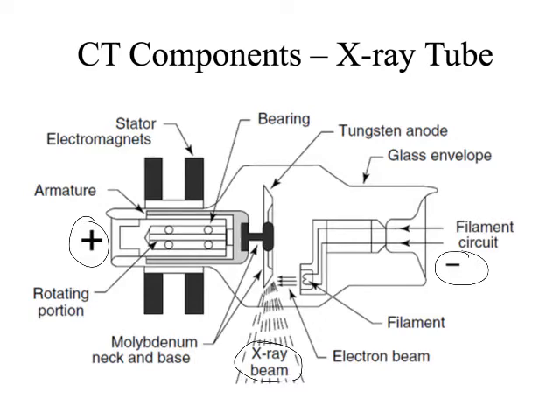Pay really close attention in your physics class when they start talking about brems, because brems is pretty much everything that we do in the diagnostic range, probably the bremsstrahlung interaction. It's a fancy German word that just means stopping. But of course in German, it's got to sound like someone died. So bremsstrahlung interactions means stopping, and what happens is we take an electron, we slam it into that tungsten anode, and as the electrons stop, they produce X-rays.